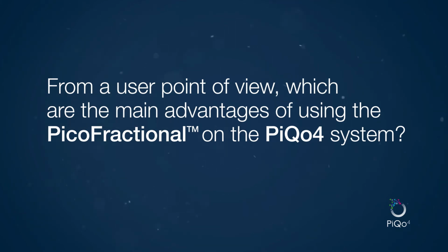The PicoFractional is excellent for maintenance procedures. We can use the PicoFractional as a standalone maintenance procedure for the fractional, but additionally, we can also use it after more aggressive procedures such as the CO2 or even Resurfix down the road. I think the biggest thing is customer satisfaction. I also think it's important to note that the ease of use and the lack of downtime really go far in convincing your patients that it's the right thing for them to do.